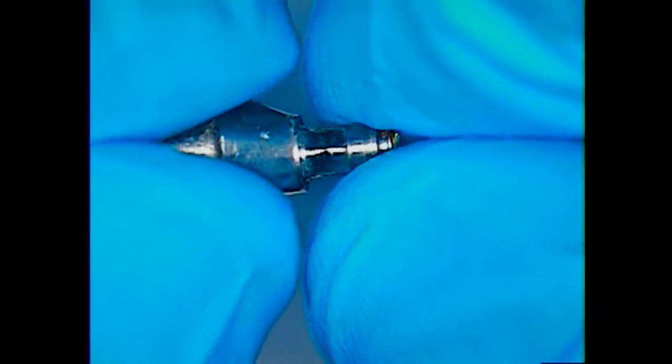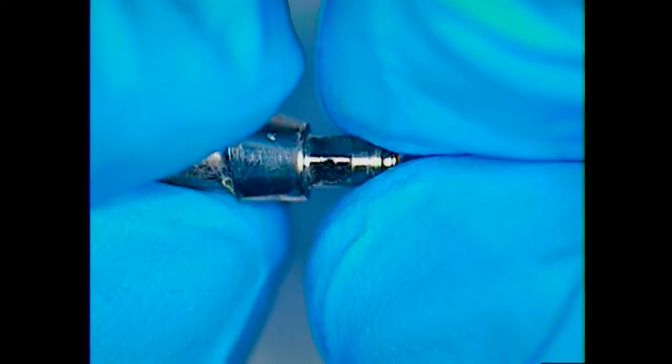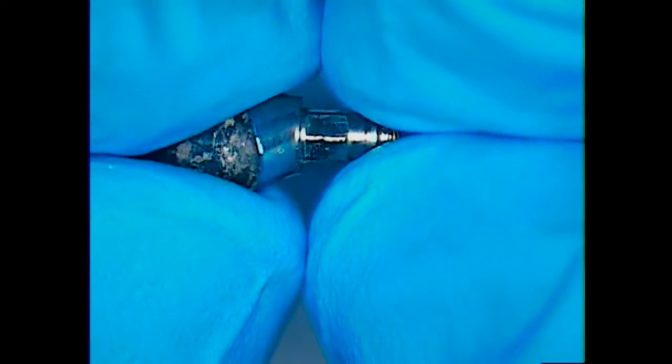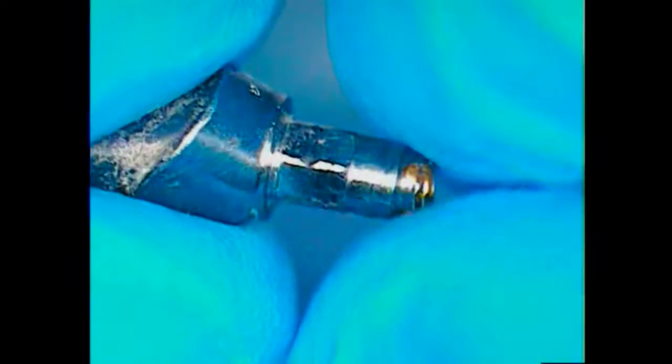I'm looking right now and checking the external aspect of the hex. That is a 6-walled hex, and there are a couple of little small dings — you can see the little dents on there. I'll polish a little bit of those but not much. There's the broken end of the screw. You can see the fragment end where the separation occurred, and the thread that kind of looks like a little leaf coming off of that.